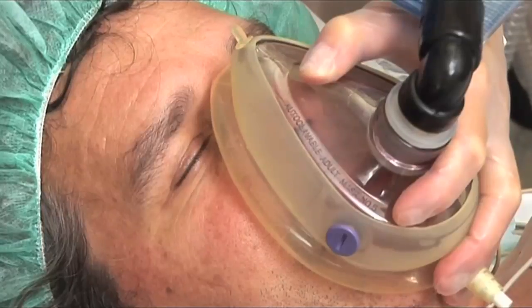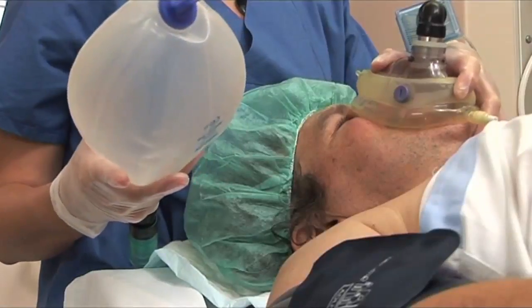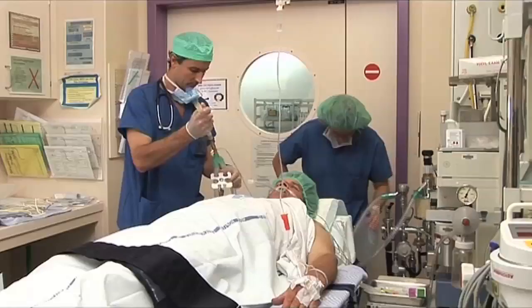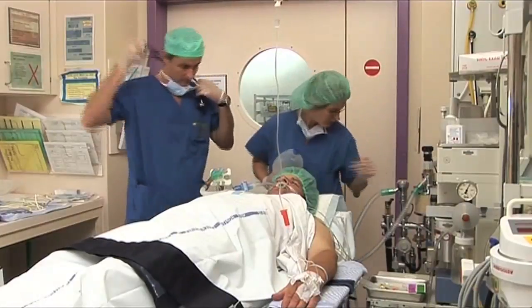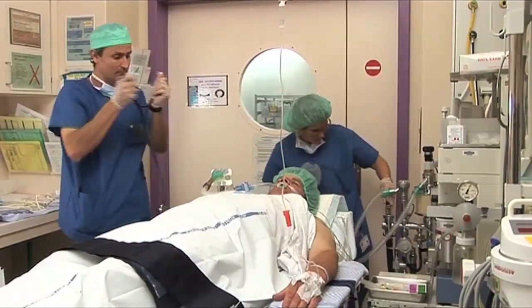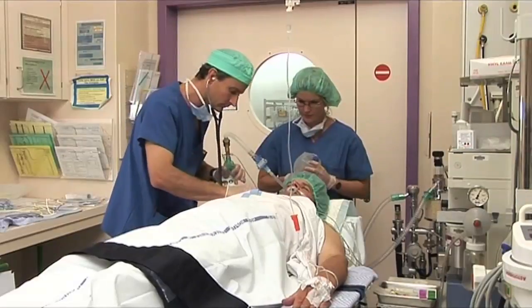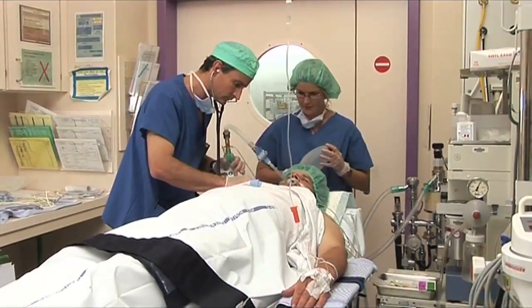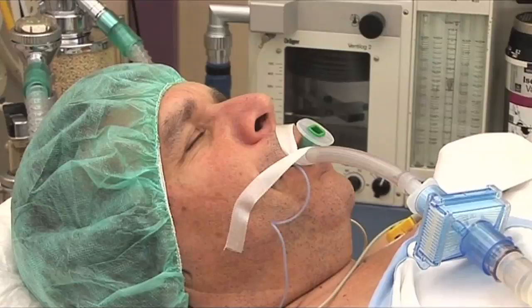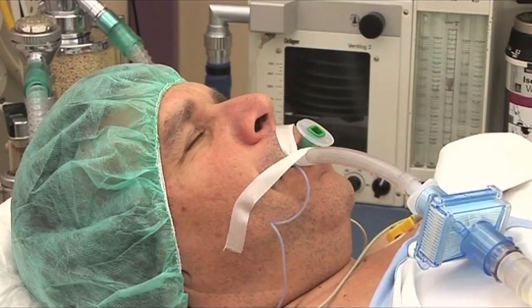Once the patient is deeply asleep and relaxed, intubation can begin. This means that a tube, also known as a catheter, is introduced into the trachea. This protects the respiratory tract — for example, by preventing regurgitation into the lungs. Intubation also helps the patient breathe, since anaesthesia actually blocks the natural breathing process.